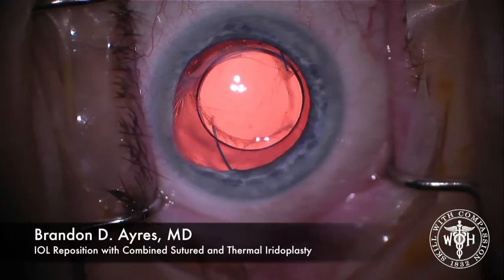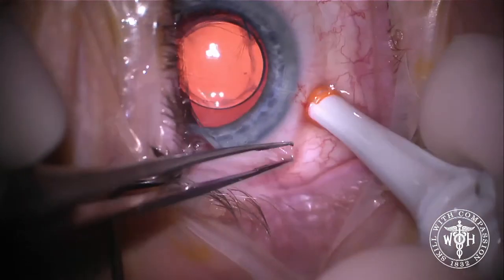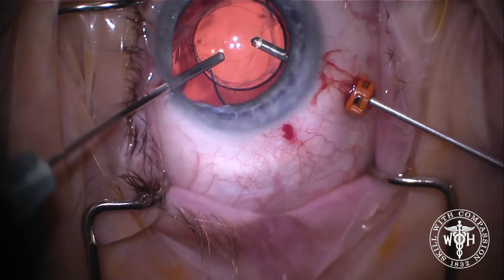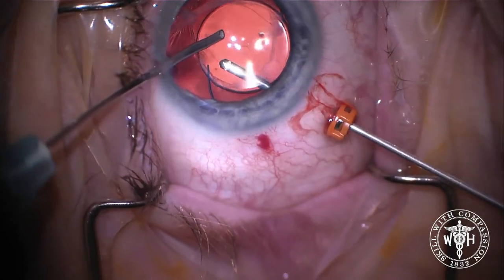Hi guys, this is an interesting case I'm going to show you. A patient had a complication of cataract surgery, needed a vitrectomy, and had a sulcus lens placed. Now over the past couple of months, she's had recurring uveitis and there's obvious pseudophagodinesis of the lens. So we're going to be repositioning this lens as well as fixing the iris.